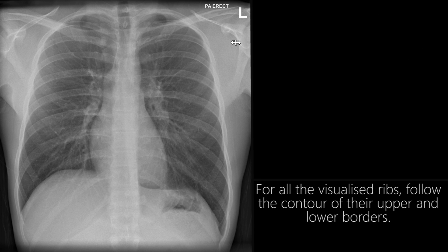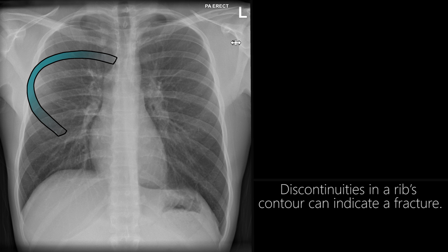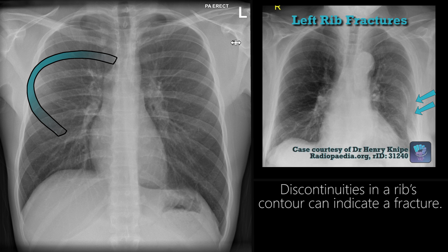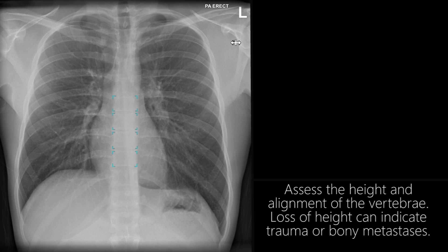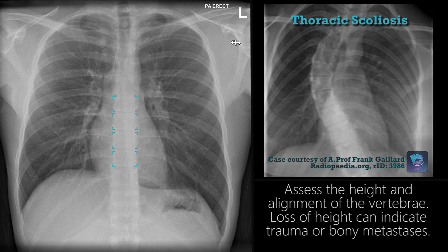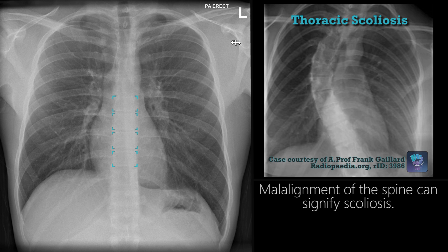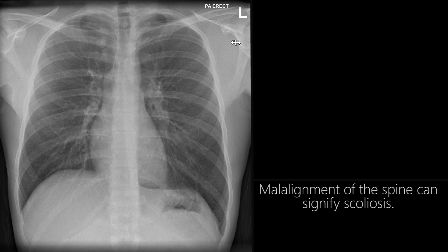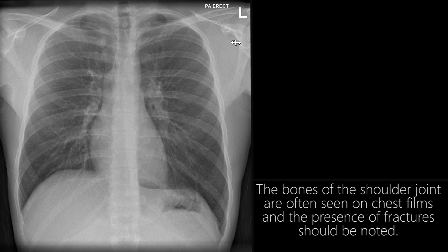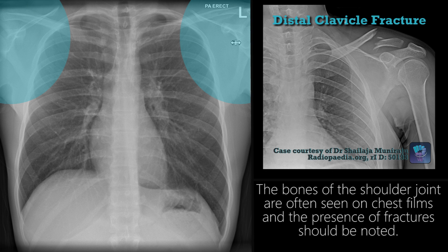For all the visualized ribs, follow the contour of their upper and lower borders. Discontinuities in a rib's contour can indicate a fracture. Assess the height and alignment of the vertebrae. Loss of height can indicate trauma or bony metastases. Malalignment of the spine can signify scoliosis. The bones of the shoulder joint are often seen on chest films, and the presence of fractures should be noted.